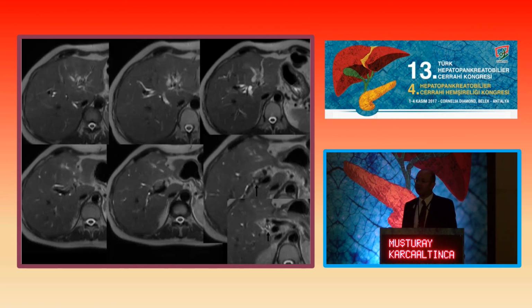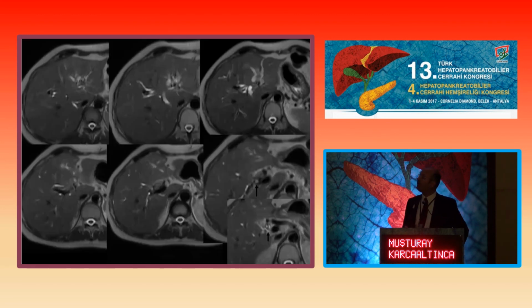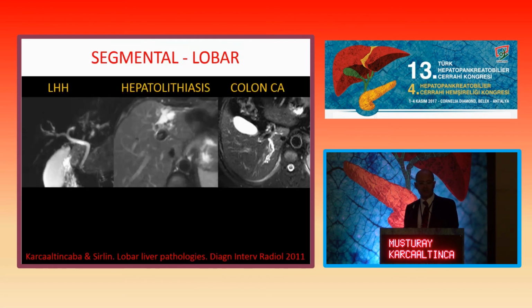And if you look at the axial images, really we don't see the tumor here. And the biopsy after the surgery in this patient was inflammatory pseudotumor. But there was so much fibrosis within this area at the hepatic hilum, they couldn't do hepaticojejunostomy. And believe it or not, we've been following this patient with bilateral catheters since 2005, and she's doing really good apart from these external drainage catheters.